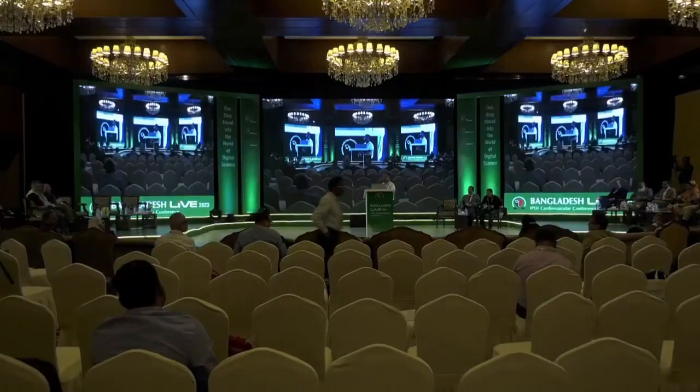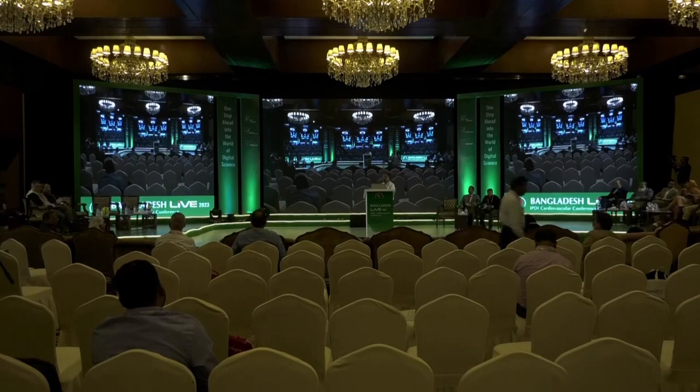Yes, sir. You know, the AL1 issue is a double-edged sword. AL1 gets in, but if it gets out, you again have to rotate it. It doesn't go back in easily. It has multiple issues around it, and of course, if you've got a smaller orifice, there's a high chance of dissection as well. That's right, sir. That's also an AL problem. So I think I love it for CTOs, but I don't like it for anything else.